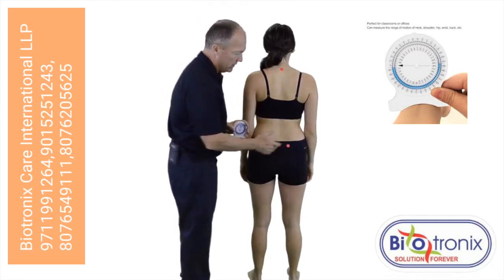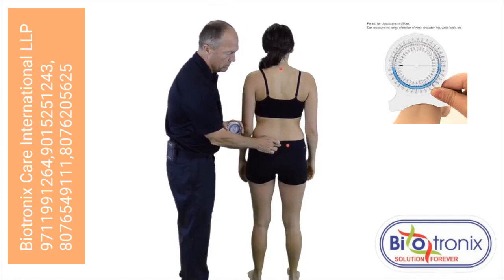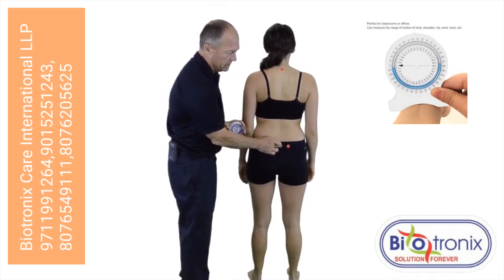Our first landmark is going to be between both PSIS over S2, and we will align an inclinometer directly over that landmark.